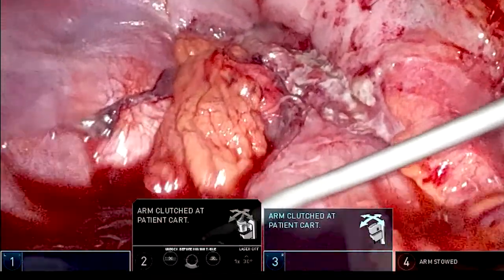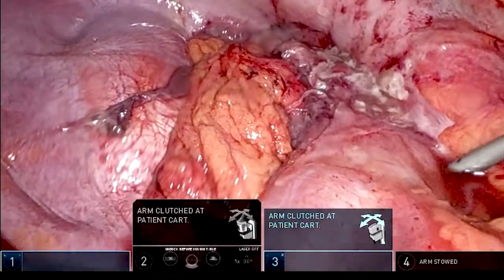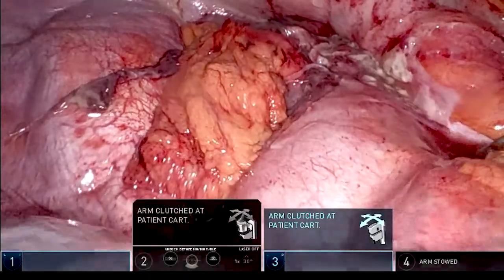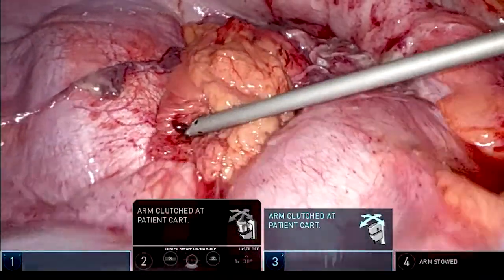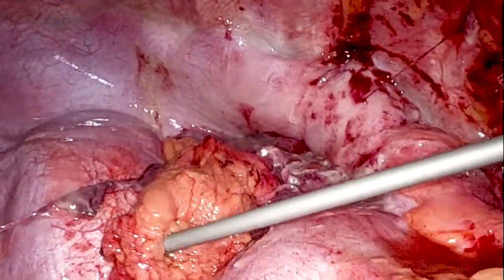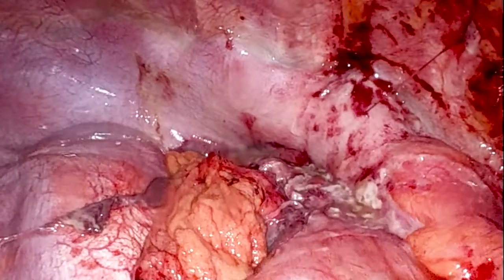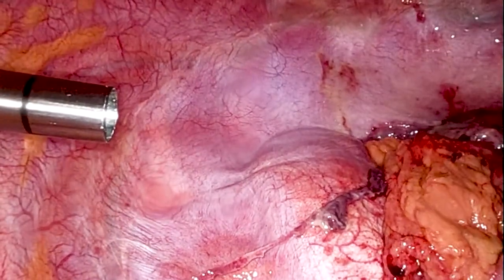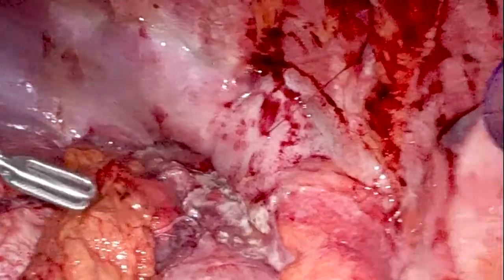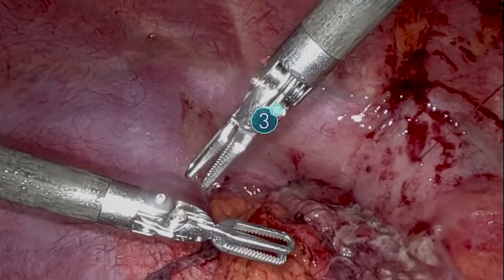A five millimetre trumpet sucker is going in to clear up the area. Ports one and three use cadier forceps and port two uses an eight millimetre camera to visualise the inside of the thorax. CO2 is blown in at eight millimetres of mercury and eight litres per minute, pushing down on the diaphragm and exposing the wound edges. The dual action of CO2 and cadier forceps allows the greater omentum to be slotted back through into the abdomen.